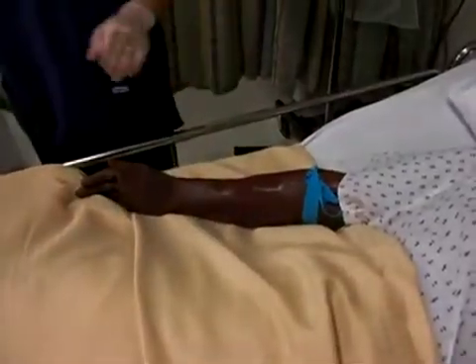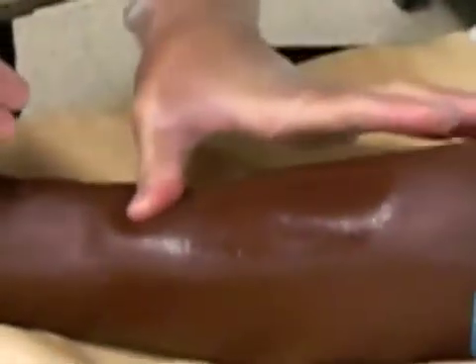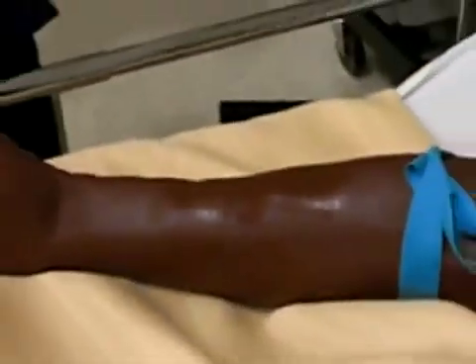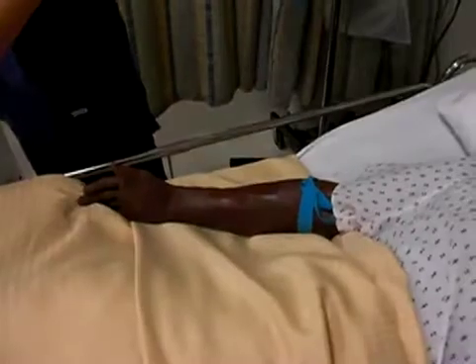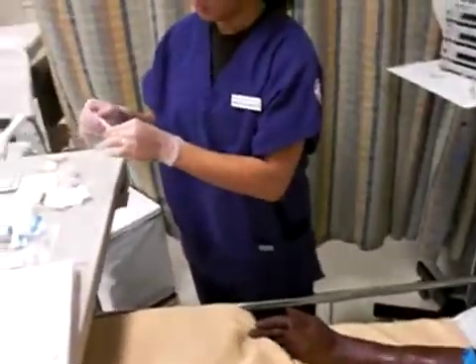The nurse anchors the vein by placing a thumb over the vein and gently tightening the skin distal to the site. The client is then warned of a sharp but quick stick. The venipuncture is now performed by holding the needle at a 10 to 30 degree angle with the bevel up, slightly distal to the actual site of the venipuncture.